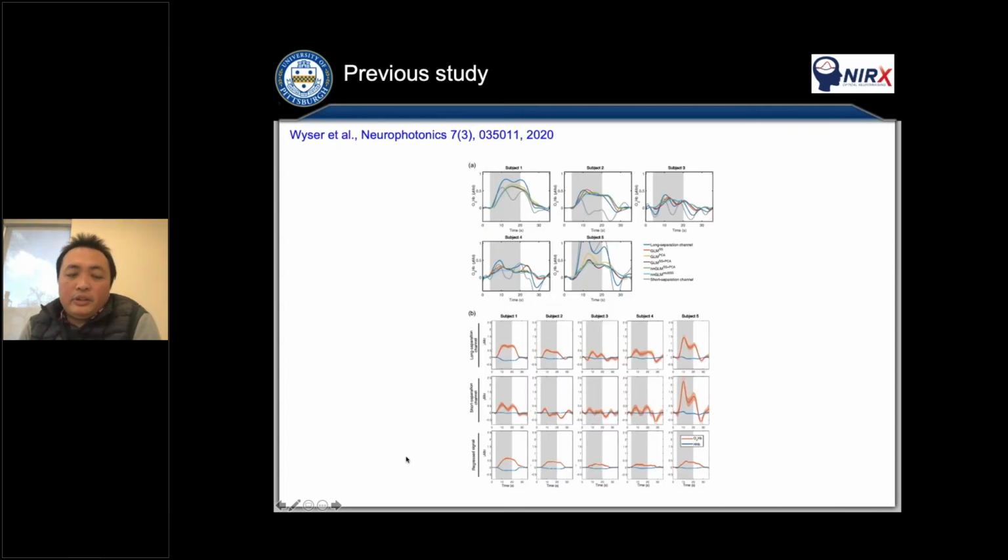And this is just for your information. This is the same system using NIRx from Felix's lab. They published this paper in Neurophotonics about one week after we published this one. It is similar: the same data set, the 8 channels, short separations, but the difference is they used hand grasping. If you see this one using long distance, subjects 1, 2, 3 until 5, and this is the short separation channel, and this is the regressed signal. So it is better to use the short separation as regression.